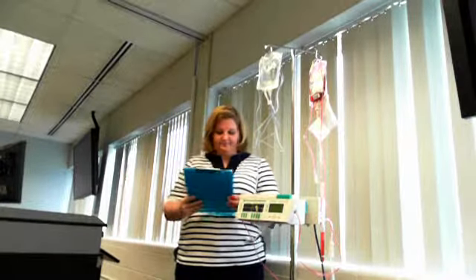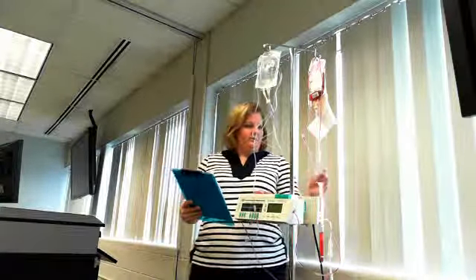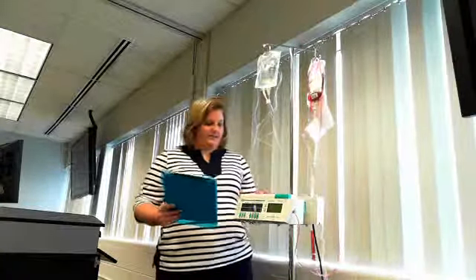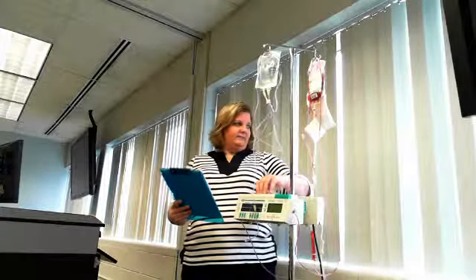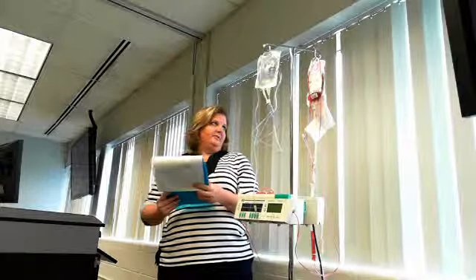This is a demonstration of how to give blood products as a med-surg nurse. You would first get an order from your physician to administer blood, make sure the doctor gave the patient risks and benefits, have a consent signed — which is good for the entire admission — and give the patient information about possible reactions and to notify you if any occur.